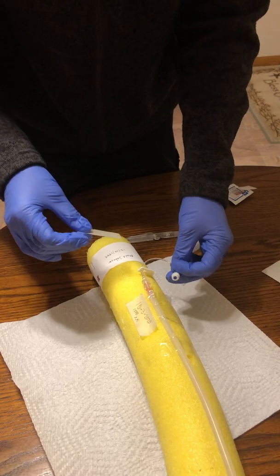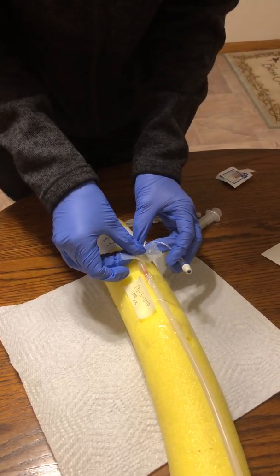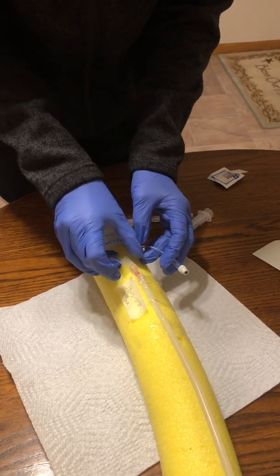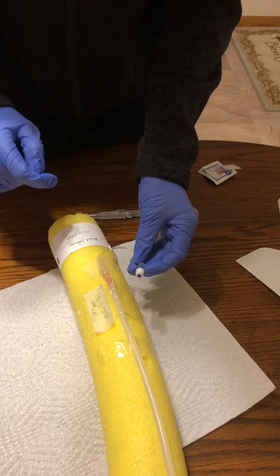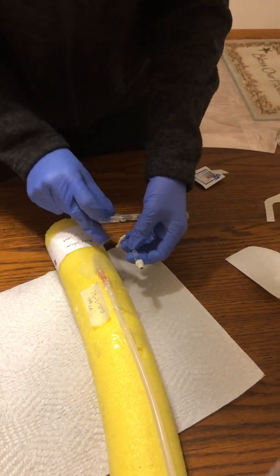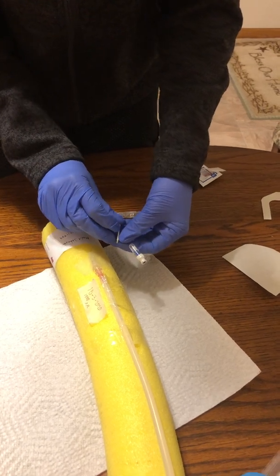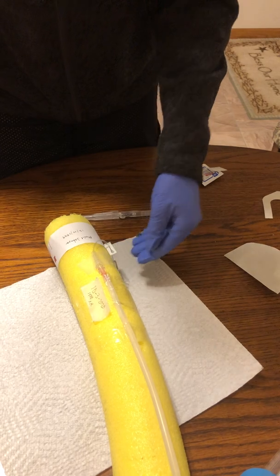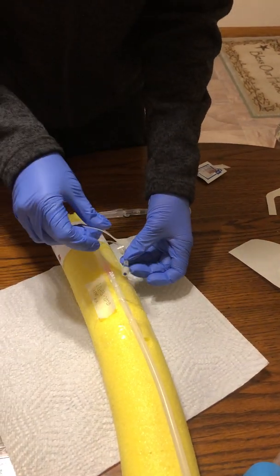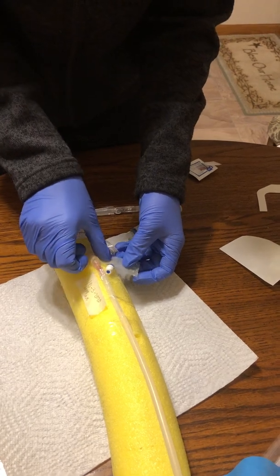So I'm going to tape right here. You never want to tape the hub. And you can see that I'm going to close this off, being very careful because I do not want to move the needle in the patient. That does not feel good. Okay.